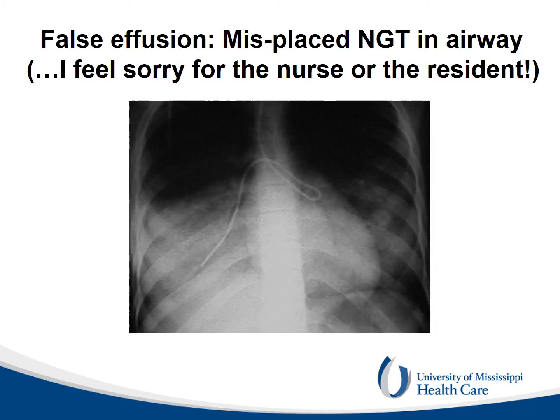A rare complication of nasogastric tube placement is depicted in this chest X-ray. The nasogastric tube goes down the trachea instead of the esophagus, then into one of the right lower lobe basilar segments. Then, being pushed farther, the middle portion coils in the left mainstem bronchus. Infusion of tube feeds floods the right lower lobe, giving the wrong image of a pleural effusion.